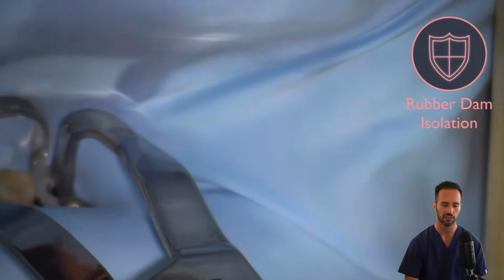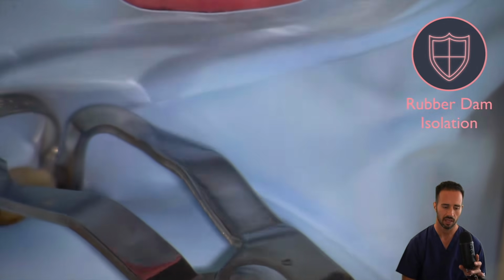So here we're placing the rubber dam on the tooth. This is a clamp number 2T on the premolar.